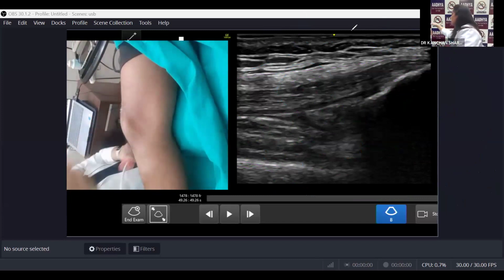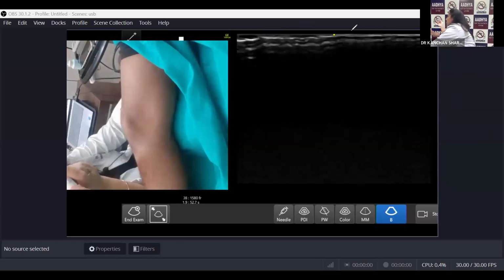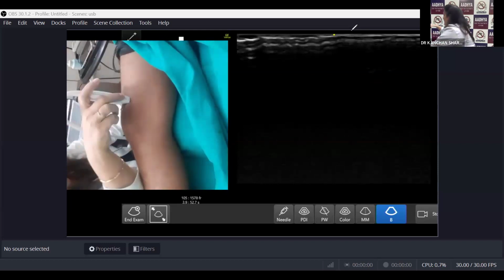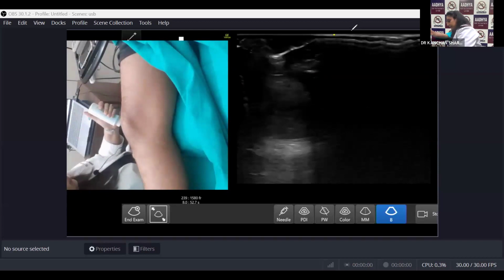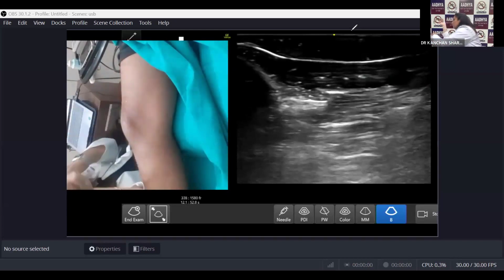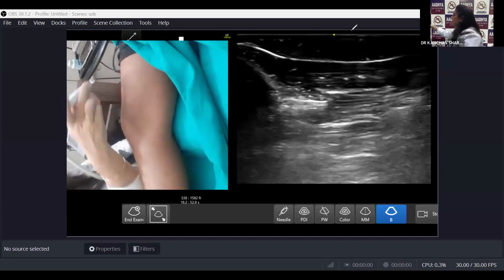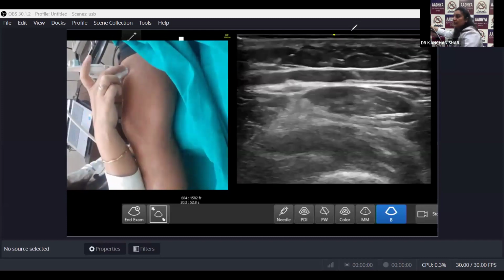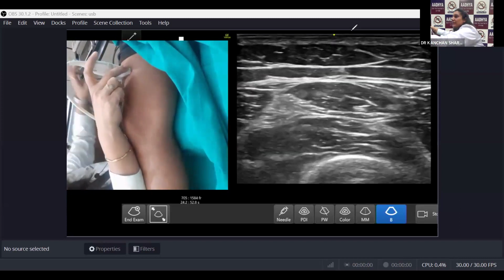So quadriceps tendon is basically made up of 4 muscles, right? So how can you identify the 4 muscles? This is what we talked about. So for that, if this is the patella, 4 fingers of mine plus 2, 6, I'll just keep it somewhere here in the short axis. Once I do that, I will see something like this.